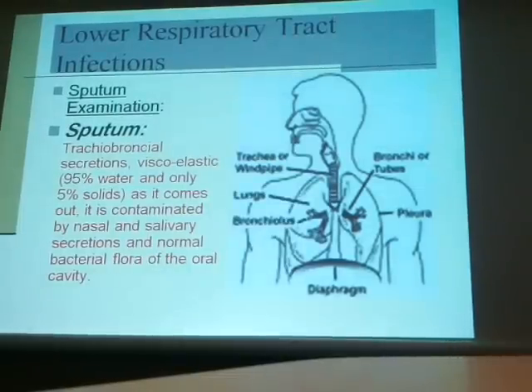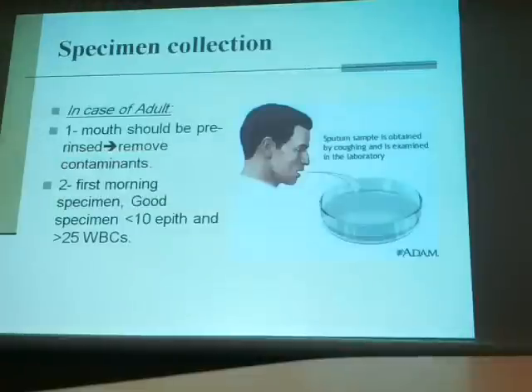So the sputum is the representative sample for lower respiratory tract infection. Okay, of course it will have contamination with nasal and oral normal bacterial flora from the oral and nasal cavity. So we ask the patient to rinse his mouth before collection of the sample. And let's say the preferable sample is the first morning sample.